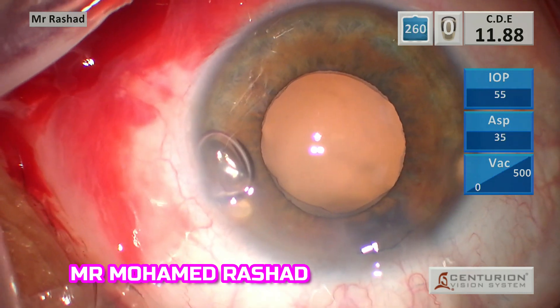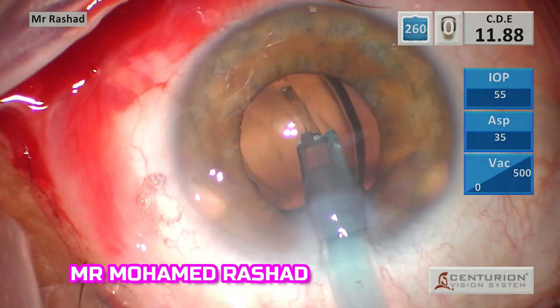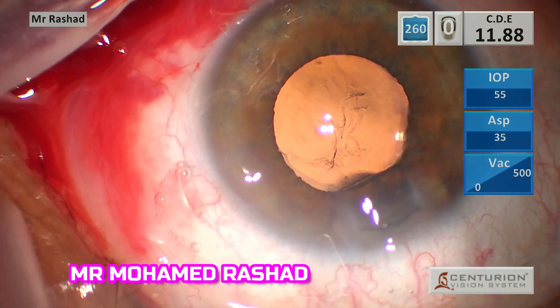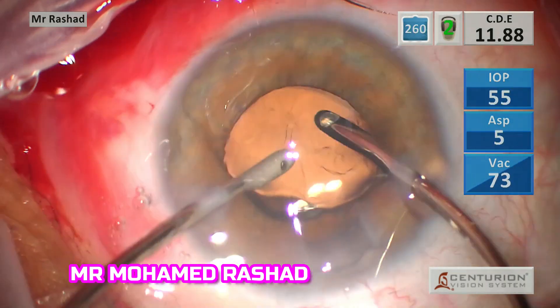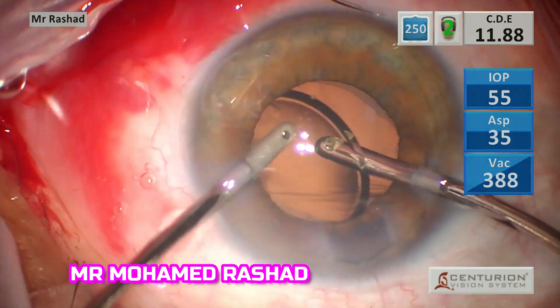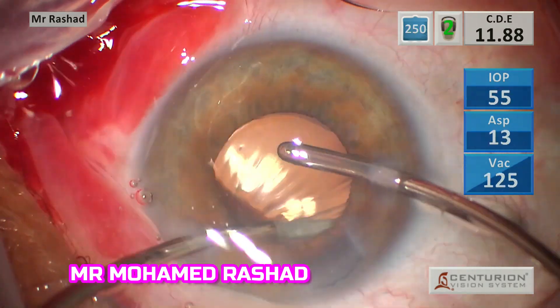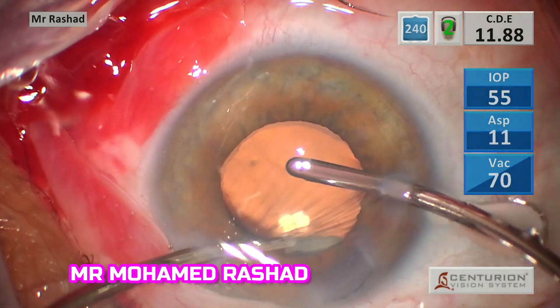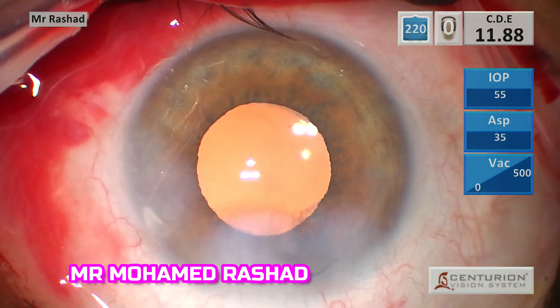Then we inject cohesive OVD inside the bag to implant the intraocular lens. I usually try to remove all the cohesive OVD to avoid a rise in intraocular pressure — I go with irrigation under the intraocular lens and aspiration in the front — and to avoid a slight myopic shift if some cohesive viscoelastic remains inside the bag. Then we inject the antibiotic and hydrate the wounds.